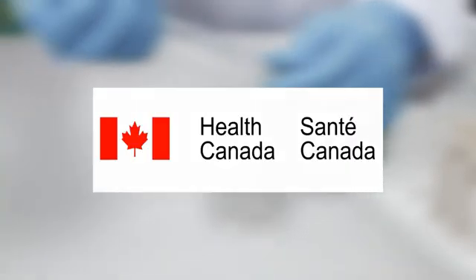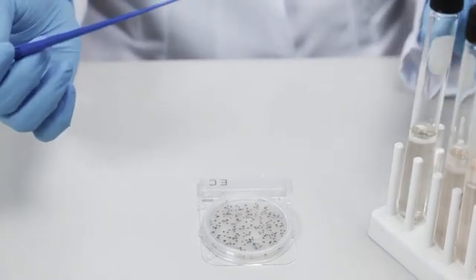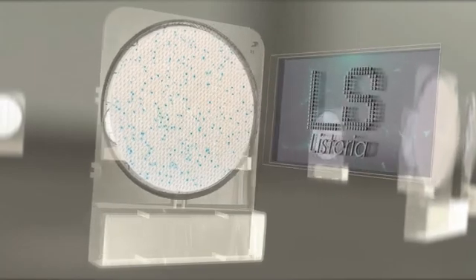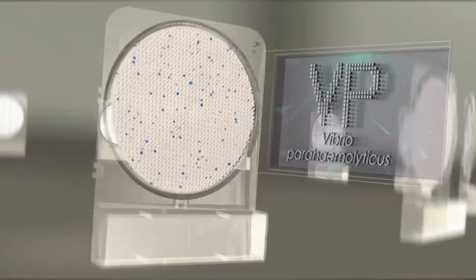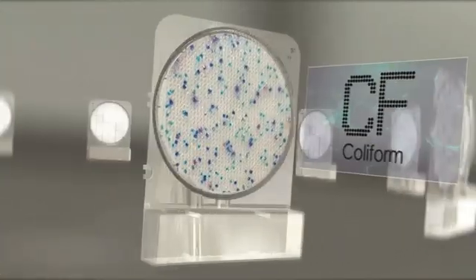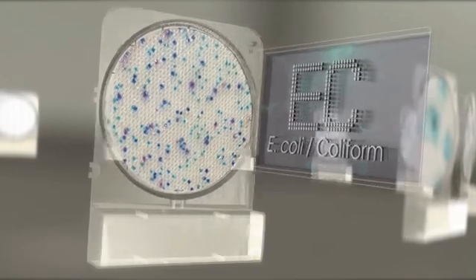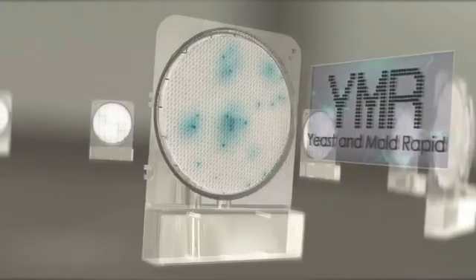Compact Dry has the widest available parameters, currently with a total of 15 parameters which includes pathogens: Salmonella, Listeria, Vibrio Parahaemolyticus. Commonly tested parameters: Total Count, Coliform, E. coli coliform, Yeast and mold, Yeast and mold rapid, Staphylococcus aureus.